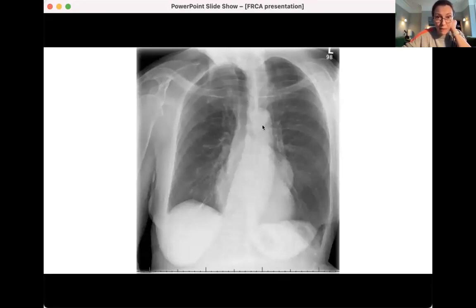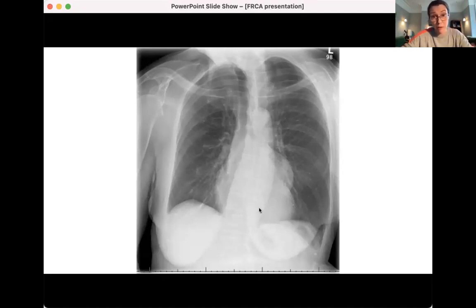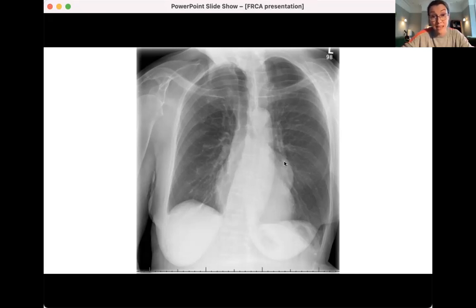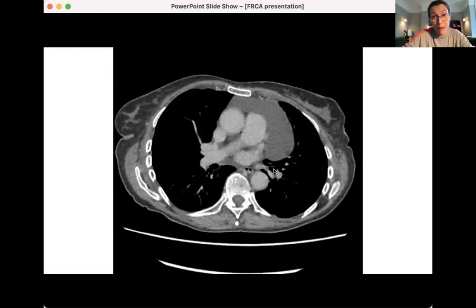In this case, thinking about mediastinal anatomy: you can see the clearly demarcated descending thoracic aorta and aortic knuckle, and there is a soft tissue mass creating a double heart border. Because you can see the aorta posteriorly, it can't be a posterior mass. The left main bronchus and pulmonary artery are not particularly distorted, so it's probably not mid-mediastinal. The heart border is partially obscured, suggesting this is an anterior mediastinal mass. The lungs are otherwise clear but hyperexpanded with emphysema and paucity of peripheral lung markings. This turned out to be an incidental pericardial cyst confirmed in the anterior mediastinum.